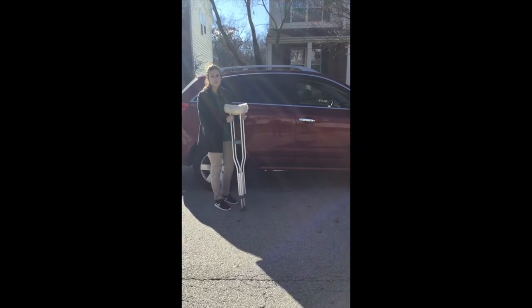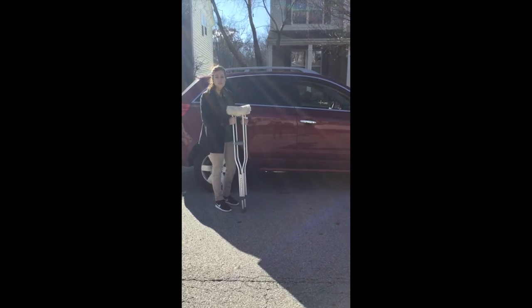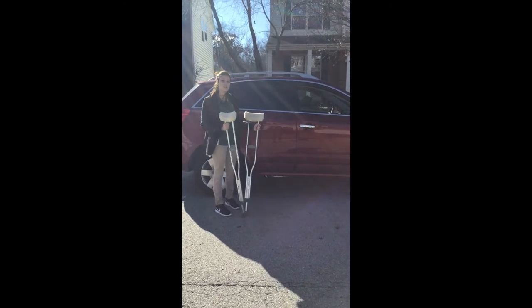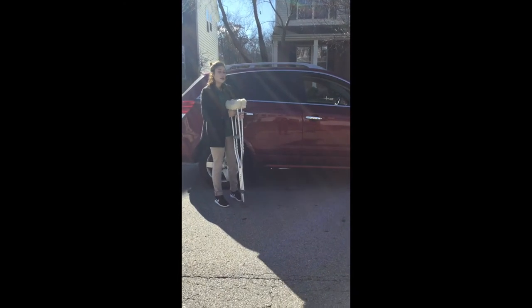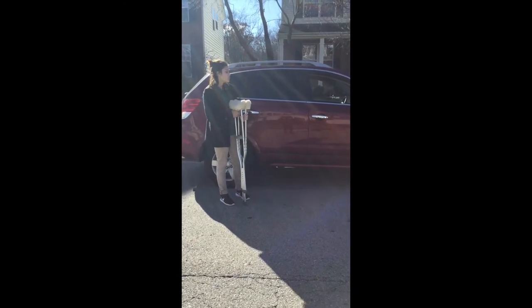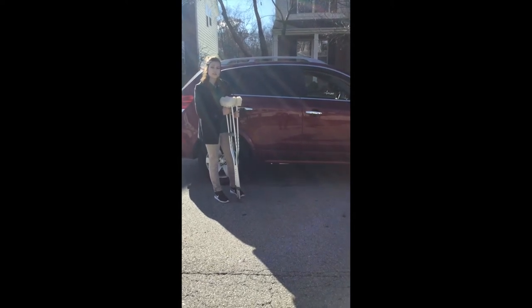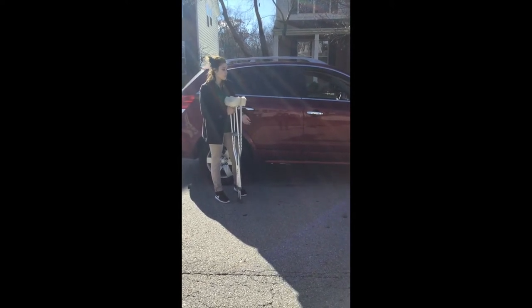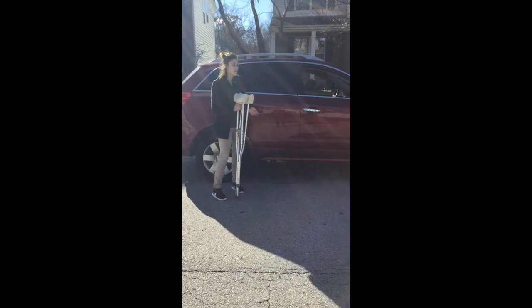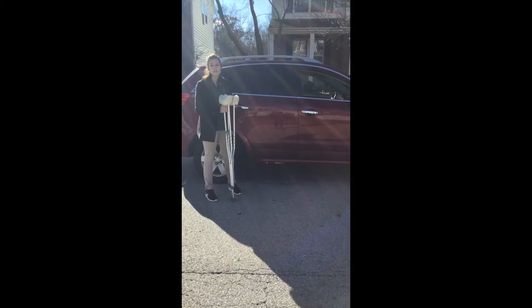Hey everyone, today I'm going to teach you how to do a car transfer using crutches as an assisted device. You will be entering the car through the passenger side, so the first thing you are going to want to do is make sure that the area is clear of all obstacles.